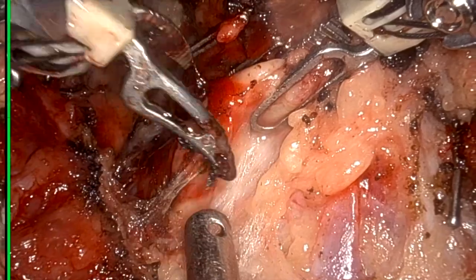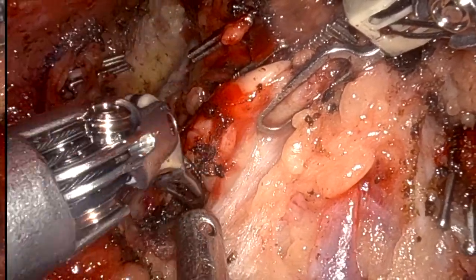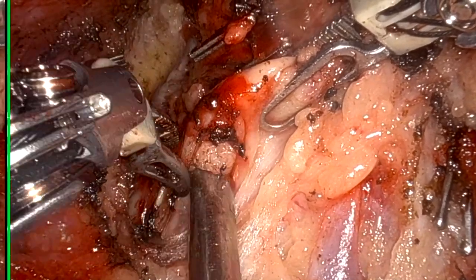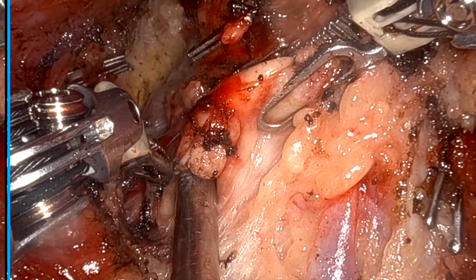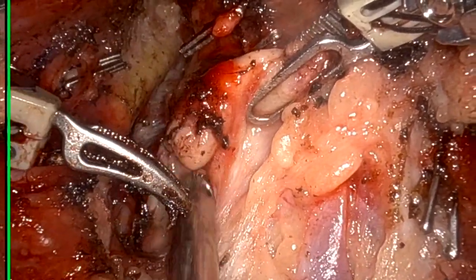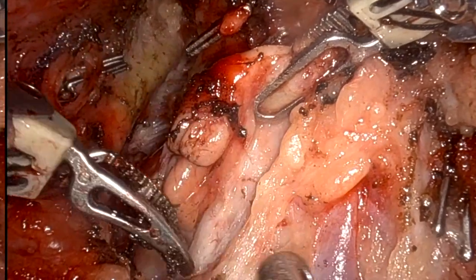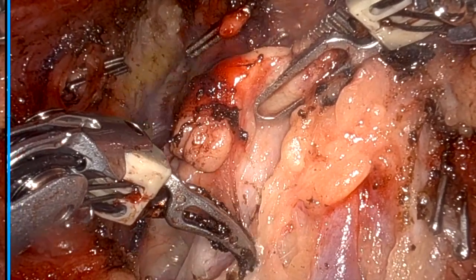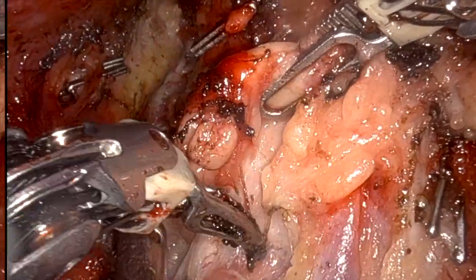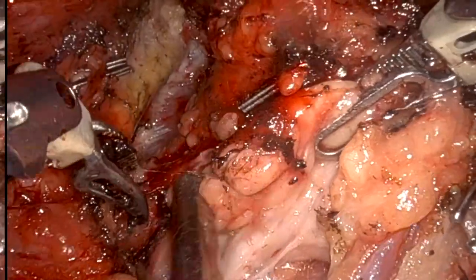So we get the facial artery. Just look at my suction, just below my suction, we will get the facial artery. Here it is. So we got the common facial vein, we got the facial artery, and now the digastric tendon is also visible.